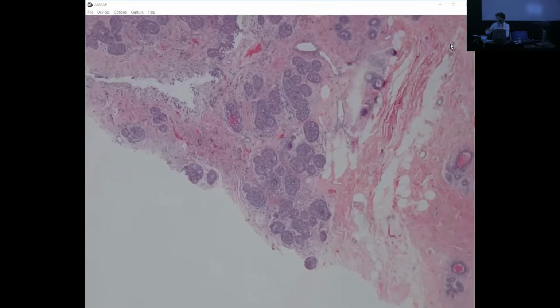Again, at low power like this, of course, these are pretty obvious, right? But I want to show you this area because you can see how at this magnification, these cells are not as cohesive as these other cells are. So these stick together. There is a lumen in the center. The lumen is filled here, but the cells are not sticking together. You see some clearing in between the nuclei that you wouldn't expect if it was a ductal proliferation.